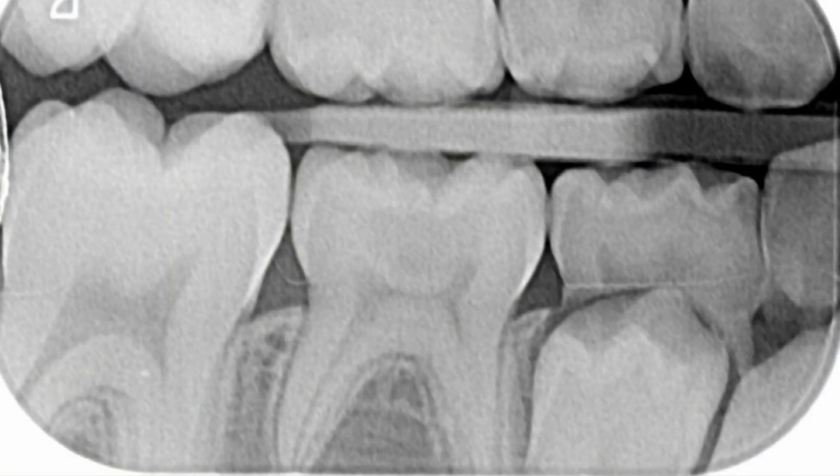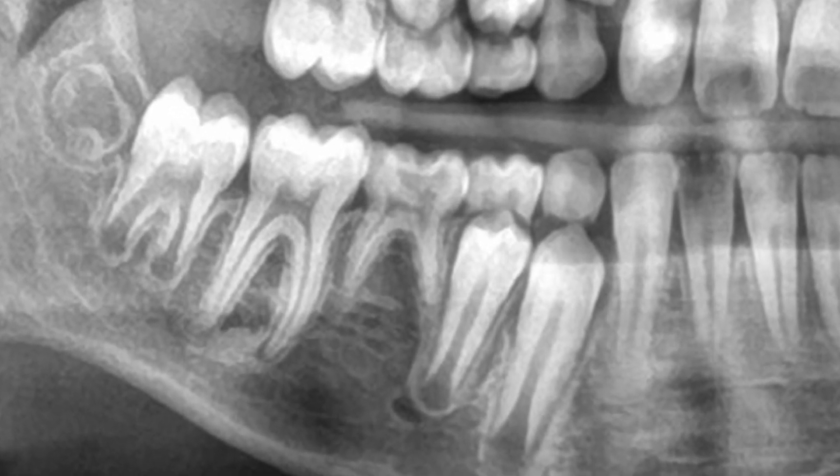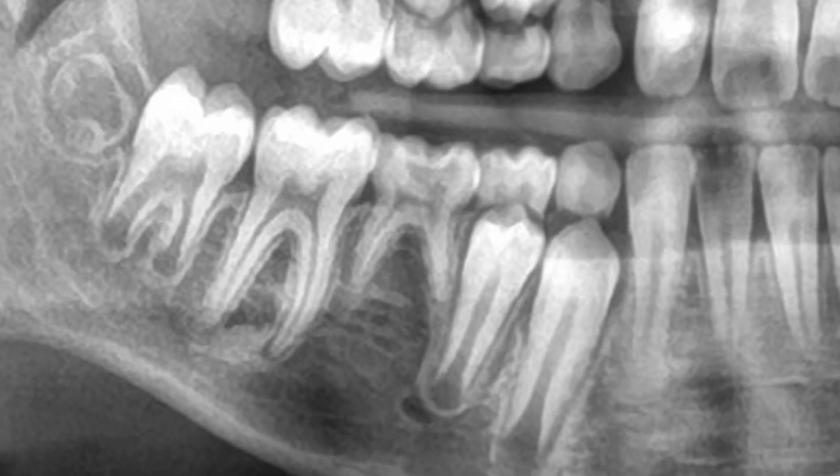If you look at the bite wing on the right hand side, you can see clearly that the lower right four is present but the lower right five is missing. There was a suspicion about whether there was a permanent successor, so I took an OPG. Some would say that's overkill, but if I suspect a missing tooth, I also suspect there may be missing teeth elsewhere. The OPG confirms the lower five is missing and the tooth has significant decay.